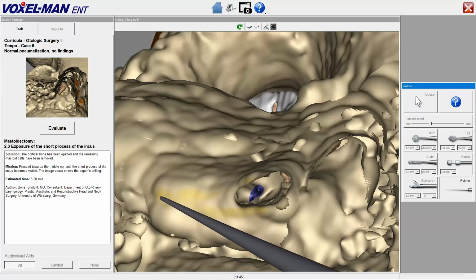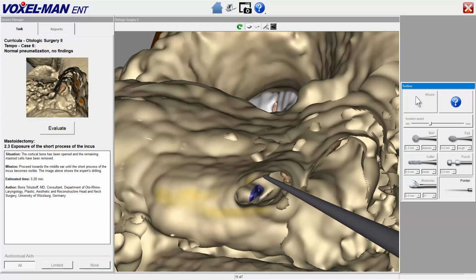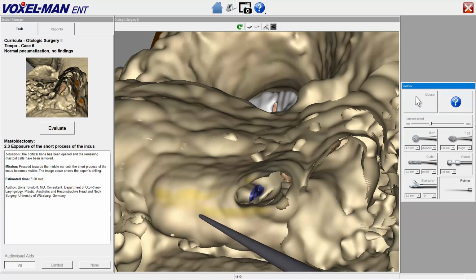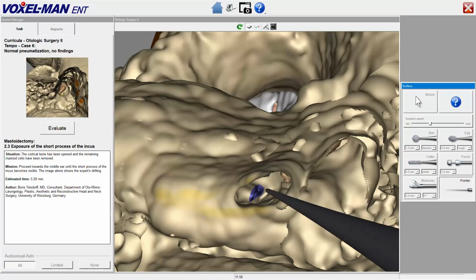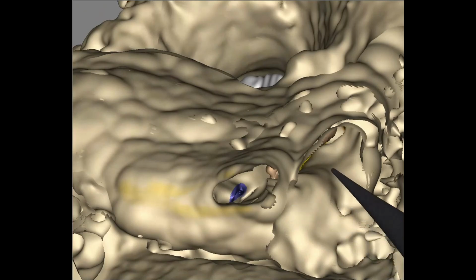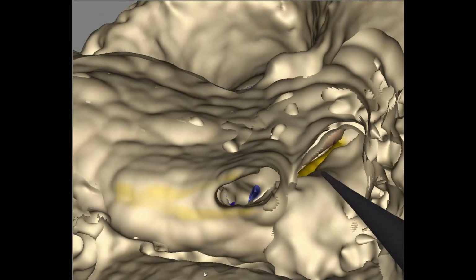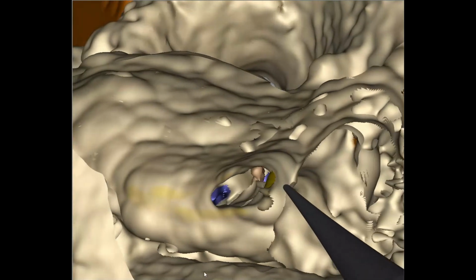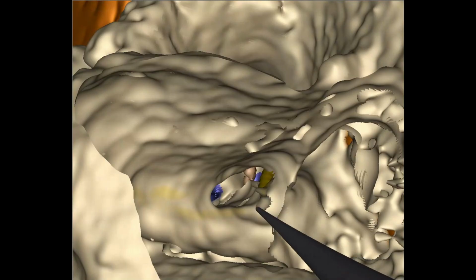Here now we see the inferior facial trunk, the chorda tympani, the rest of the mastoid segment of facial nerve, the round window niche and promontory, the incus buttress, the lateral canal, the tympanic or horizontal facial nerve, its second genu, where it becomes the mastoid segment.